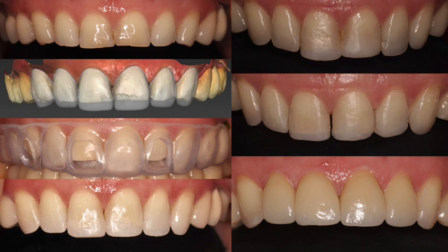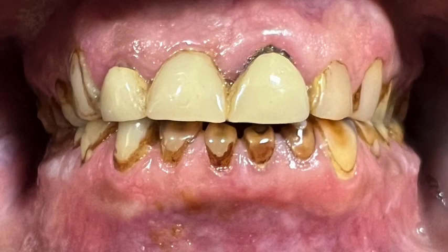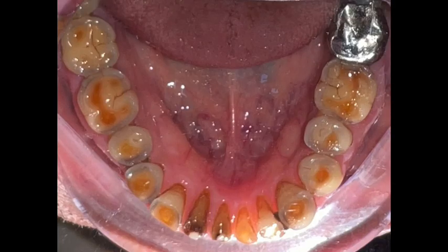Ideally, if the patient is being monitored closely, I would naturally not cut any tooth structure. But there are times when the tooth is completely gone, and then you need to give something like lithium disilicate crowns to patients like that. But you don't give this when the patient is 30-40 years old. You give this as you graduate. This patient must be around 60 years old. Another case came just the other day, and this is a challenging case for us. This of course goes for a full mouth rehabilitation with a prosthodontist. So that's what we did.